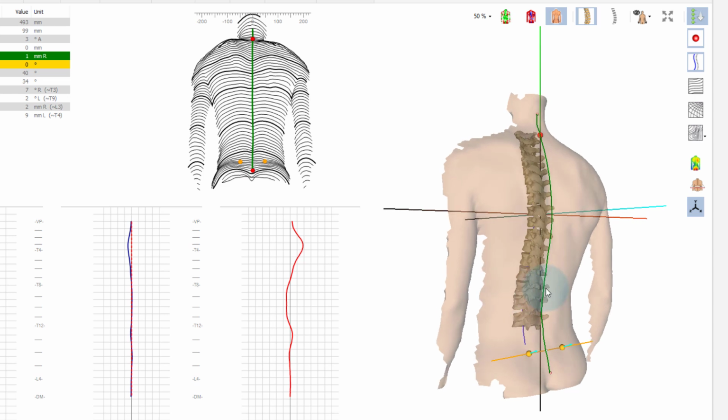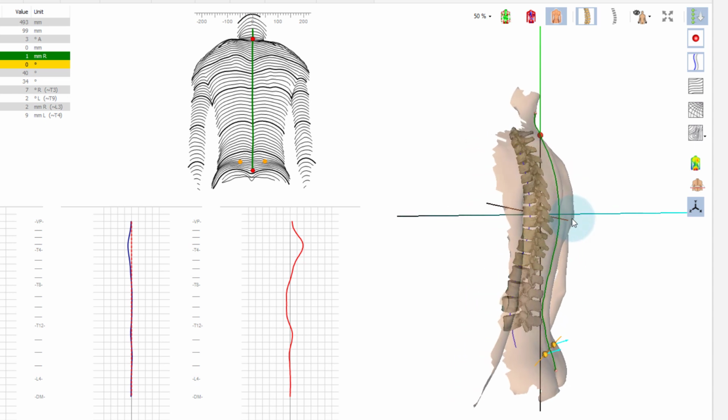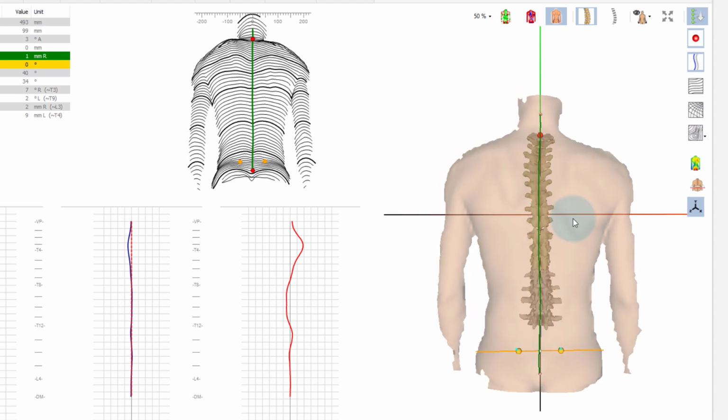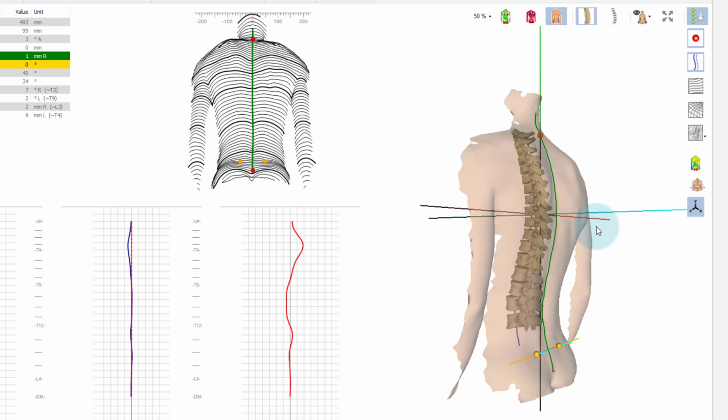The position of the crosshair corresponds to the position of the calibration plane of the stripe projection. Where the three axes meet is the center of the middle stripe in the pattern. And this is exactly at the measured optimum distance. Thus, it is easy to see whether a patient has been positioned at the correct distance or whether the stripe projection has been set to the correct height.